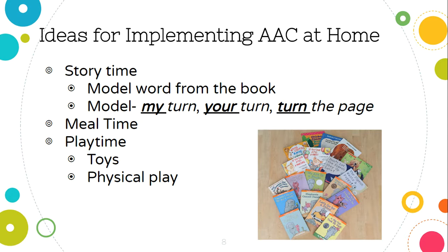So again, if you have a specific activity or toy that your child really likes to play with, I'm happy to help brainstorm as well if you're having a hard time thinking of a word.